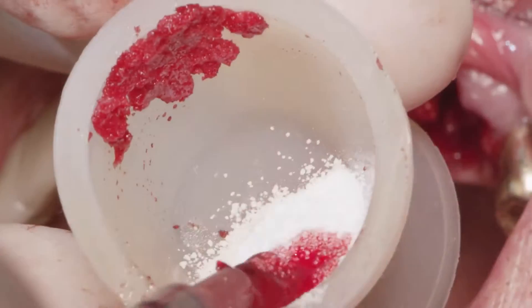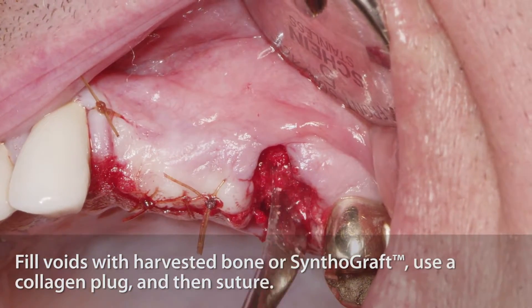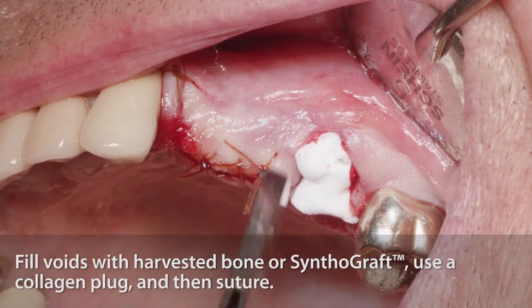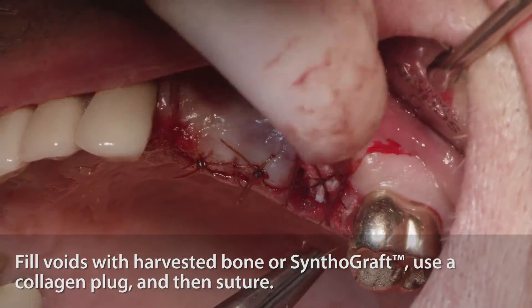Once you finish the osteotomy preparation, you fill the voids with harvested bone or bone graft material, as we mentioned before. Using a collagen plug also protects the socket. Then suture, and have the implant stable and protected, surrounded by bone graft material.